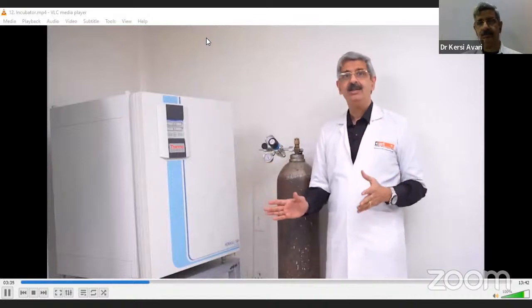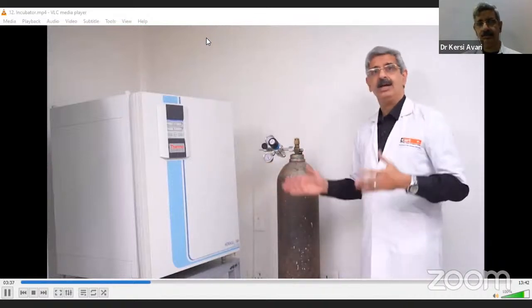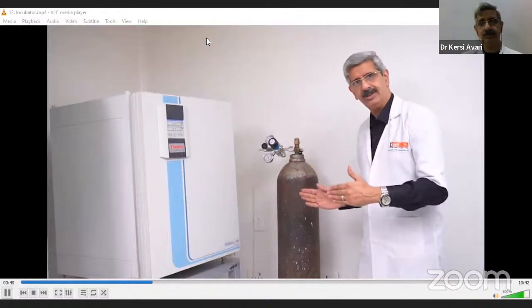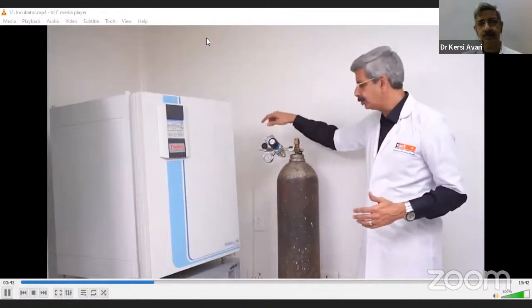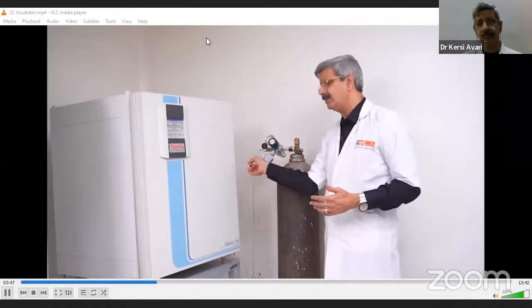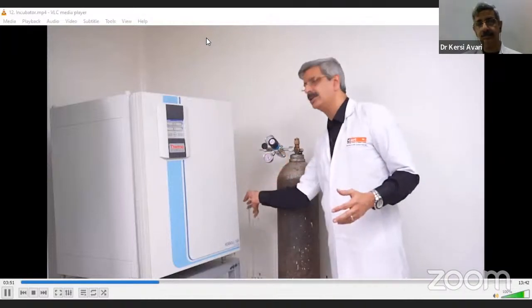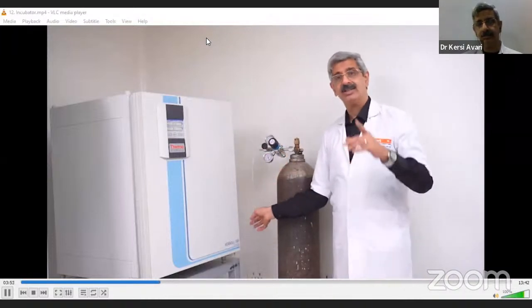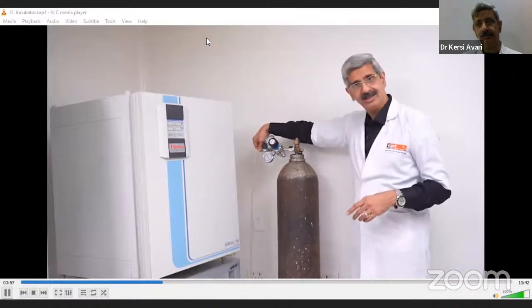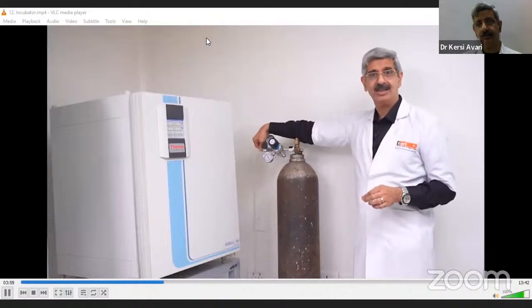So it is advisable that you have a utility room just adjacent to your laboratory, maybe a hole drilled in the wall through which your delivery tube can pass, and the distance between the incubator and the cylinder should not be very much. Don't keep layers or meters of charging lines, because there are also many other accessories. There are the clamps, there are the holders, there are the thread sealing tapes.